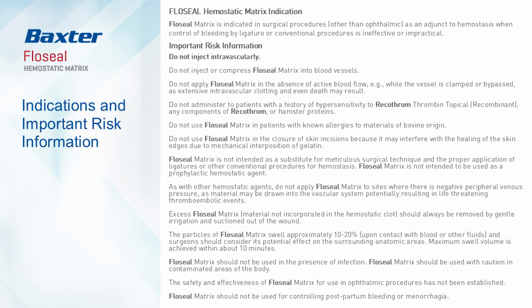FLOSEAL matrix should not be used in the presence of infection. FLOSEAL matrix should be used with caution in contaminated areas of the body. The safety and effectiveness of FLOSEAL matrix for use in ophthalmic procedures has not been established. FLOSEAL matrix should not be used for controlling postpartum bleeding or menorrhagia.